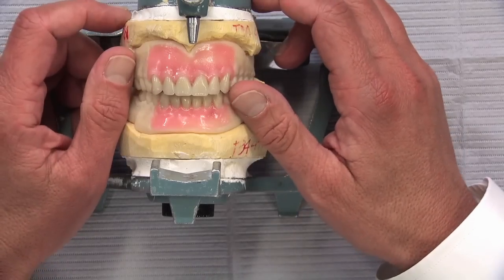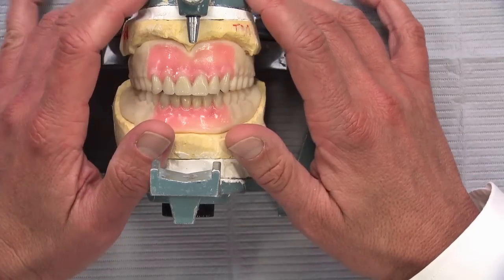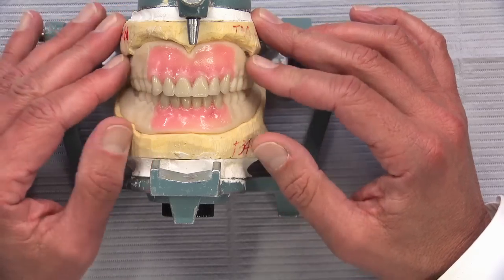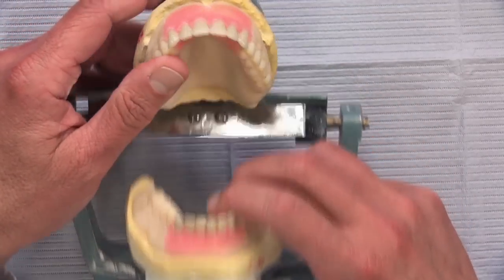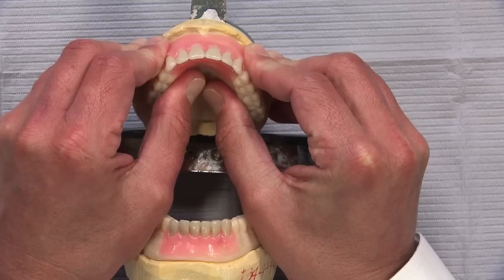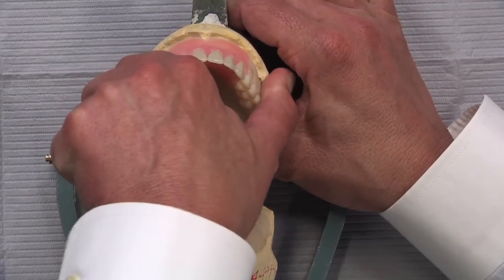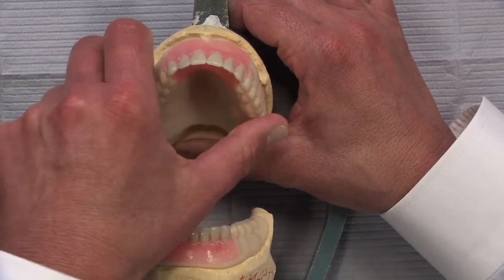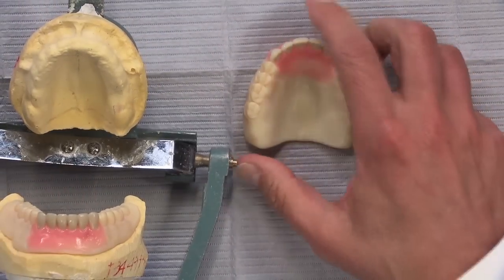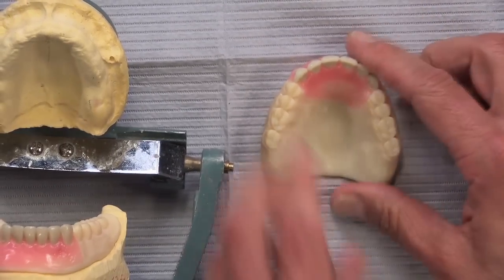The first part is the same — you take the master impressions, send them in to us, and we pour up the models. Then we scan that, and instead of sending anything back like wax bite blocks, this is actually what we're able to send back to you. You're going to notice something you really haven't seen before when taking it off the model — you have to struggle just a little bit to get it off because of the intimate fit between this and the stone model, because this is actually printed on a 3D object printer.